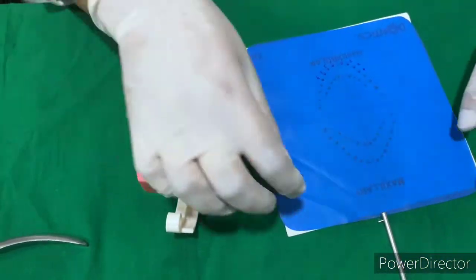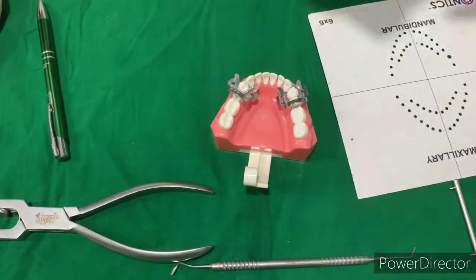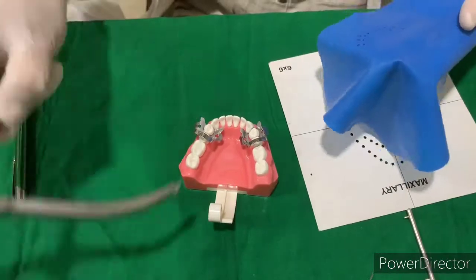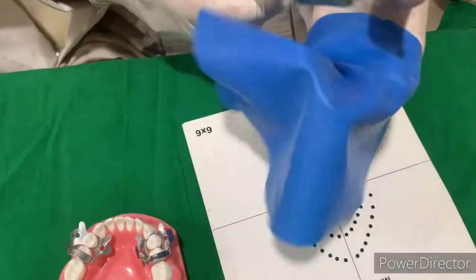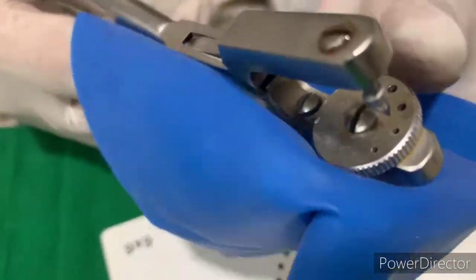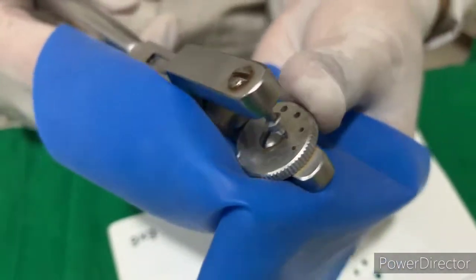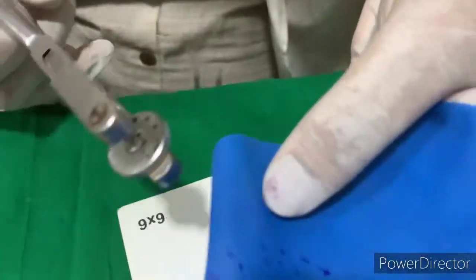Then we'll punch the sheet. First select the anterior hole, then punch it.